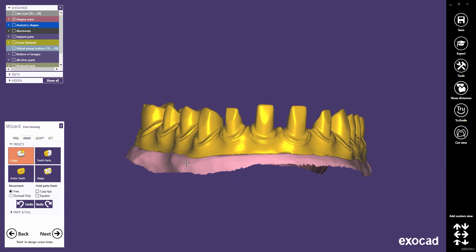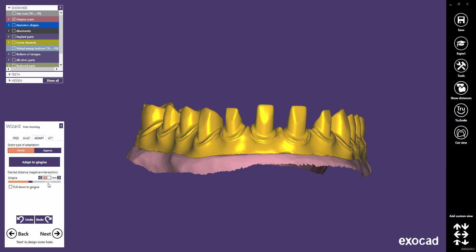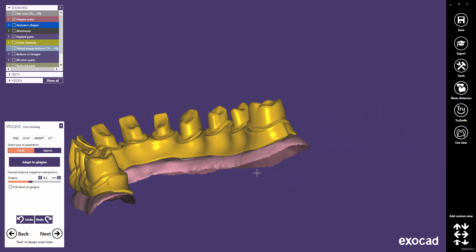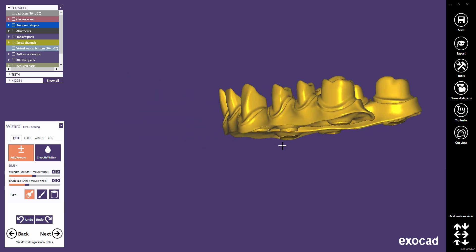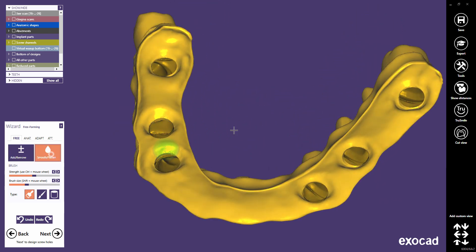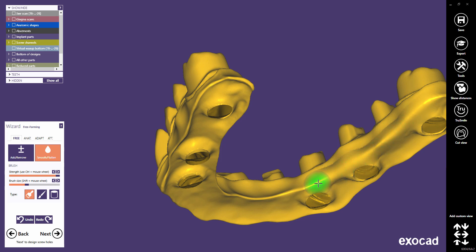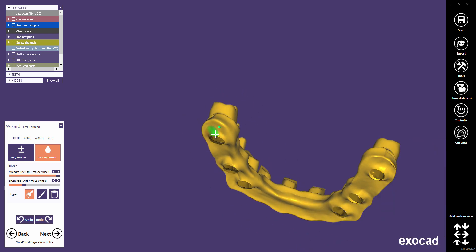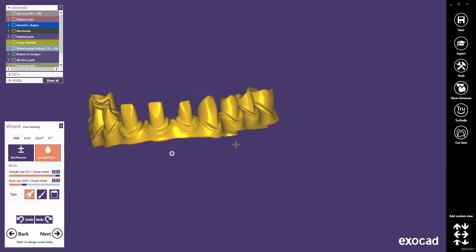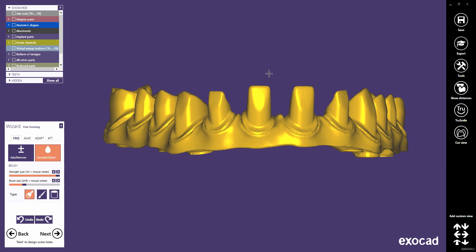Here you can use the Adapt feature to create a uniform gap between the restoration and gingiva. Furthermore, you can add and remove material, smooth parts, or move bigger areas. Click Next to proceed to the next step.